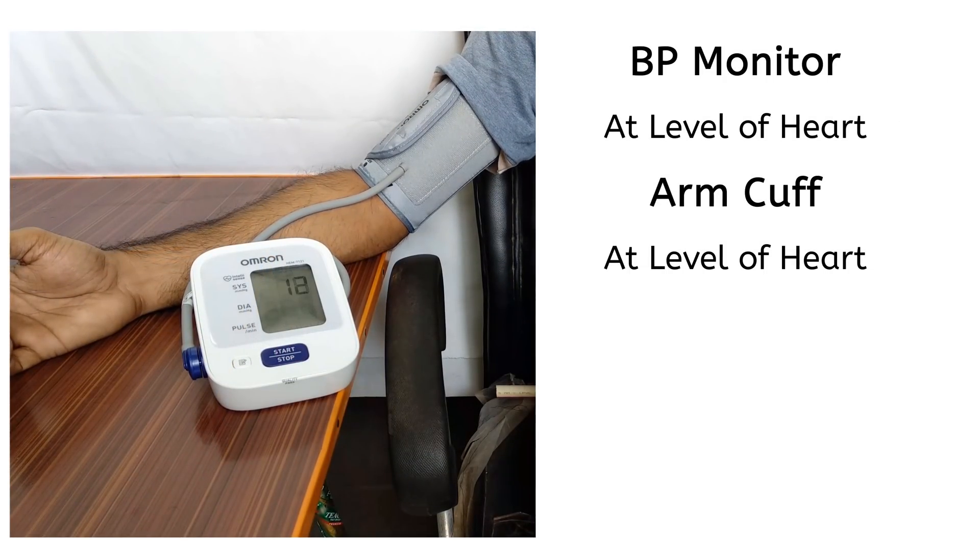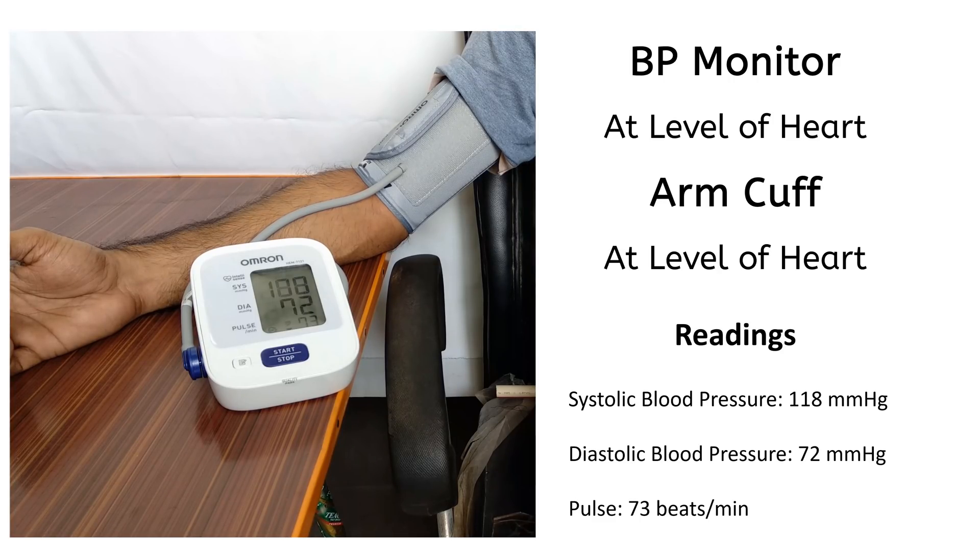This position is with BP monitor at the level of heart and the arm cuff above the level of heart. These are the readings on the monitor.